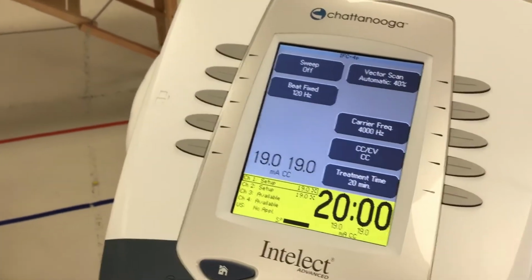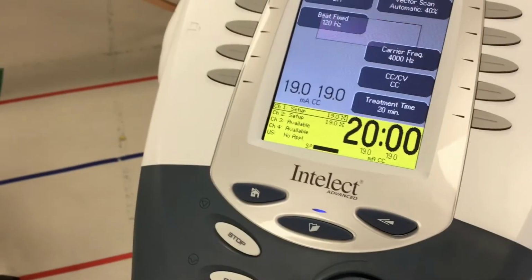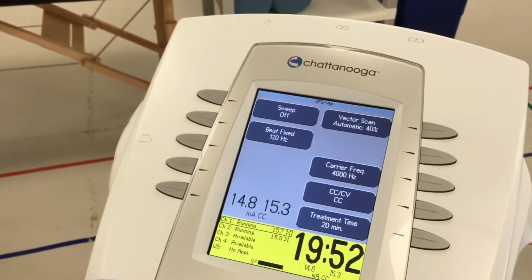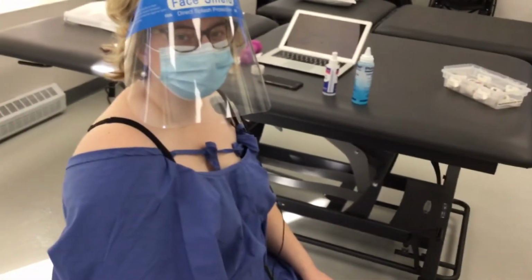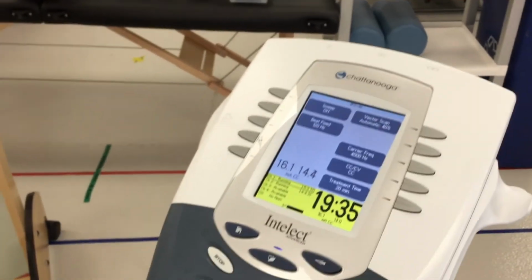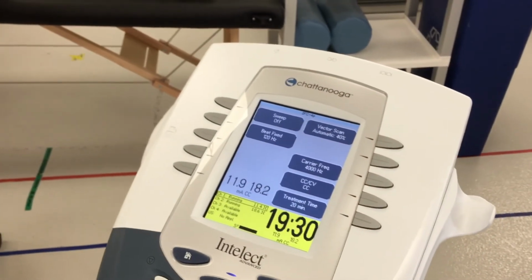Again, we haven't started it yet, so there's no modulation happening there. When we press start, because it's on a vector scan, the current is going to move from one to the other. So now what I want you to do with your partners is really define what that feeling is. We won't ask Layla because you'll get a chance to feel that in the lab. All right, so that's 4-pole interferential current. You will also have a chance to try it with pre-modulated or just the 2 poles.